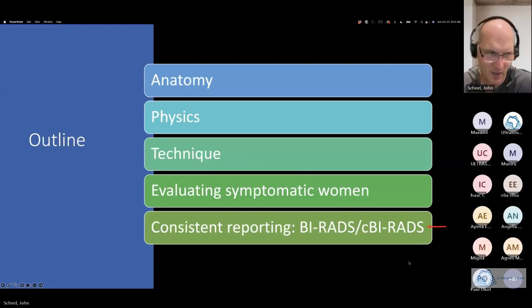And then if they don't know, or they say, oh, it's one side, but I don't know, then you can actually take your hands on the breast and move up the breast so that it's kind of like milking, and it can cause the discharge to come out.